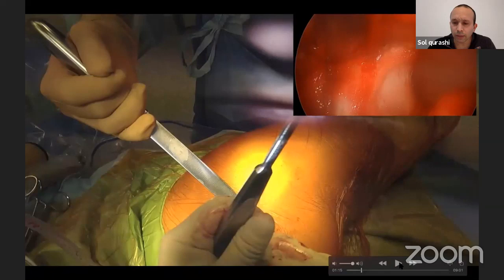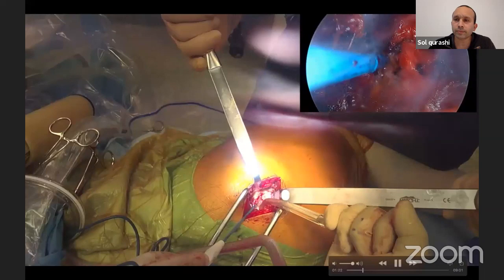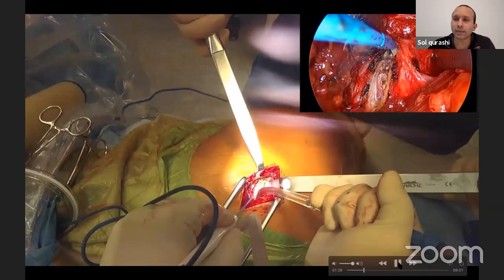Okay, so then you're looking at the top of the capsule. So you cut the capsule like that with a long diathermy tip all the way to the back. Okay, now I'm looking at the top of the femoral neck. Expose it a little bit more.